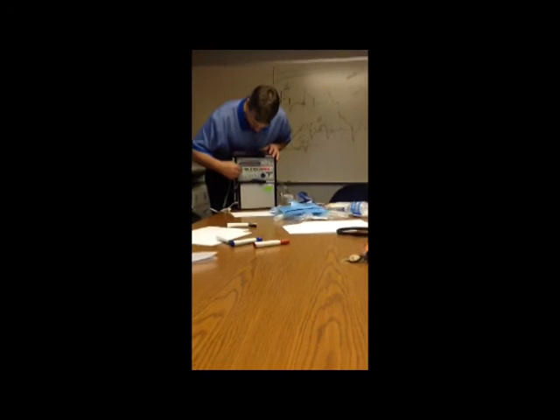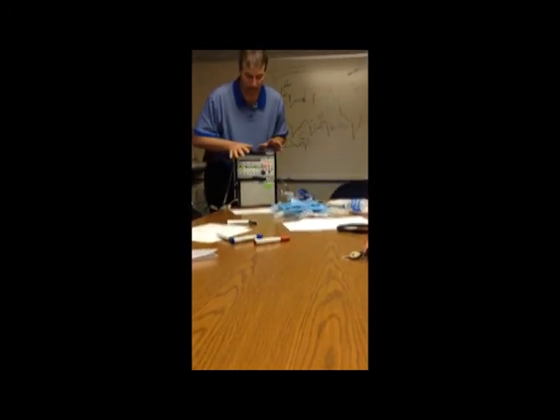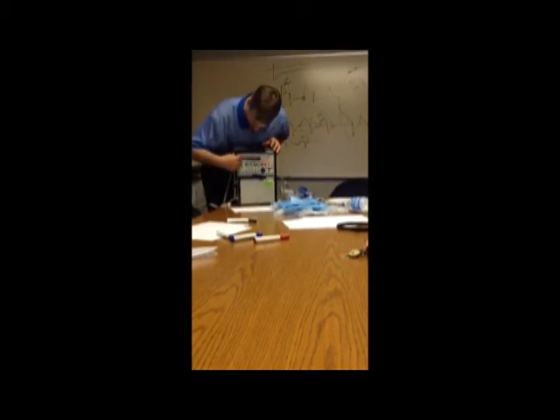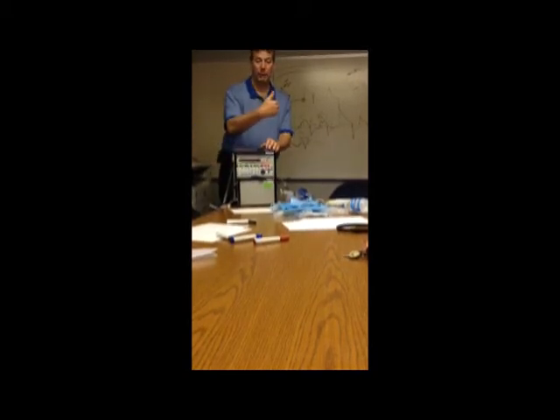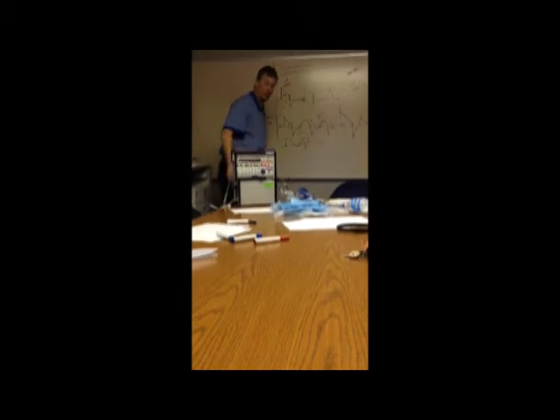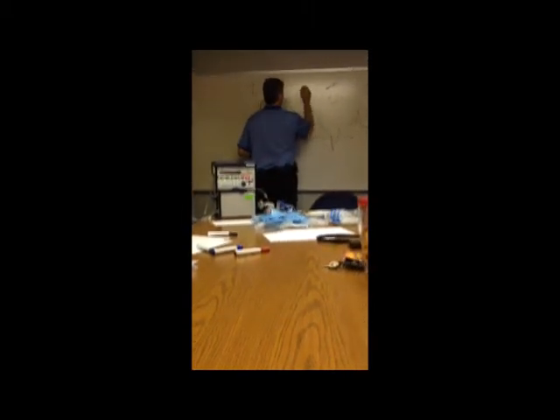I'm not sure I'm going to be able to do this on this vent, but I'll try to make it simple. You got a patient on a tidal volume set, and it only applies in volume mode, and I'm going to explain volume and pressure in just a minute. That pressure manometer either starts up, then drops back down, and then goes back up.